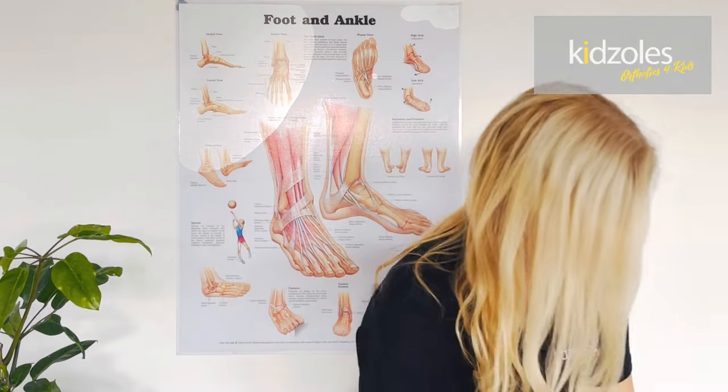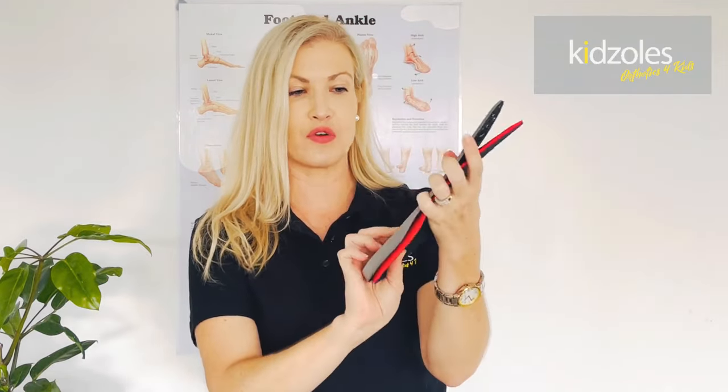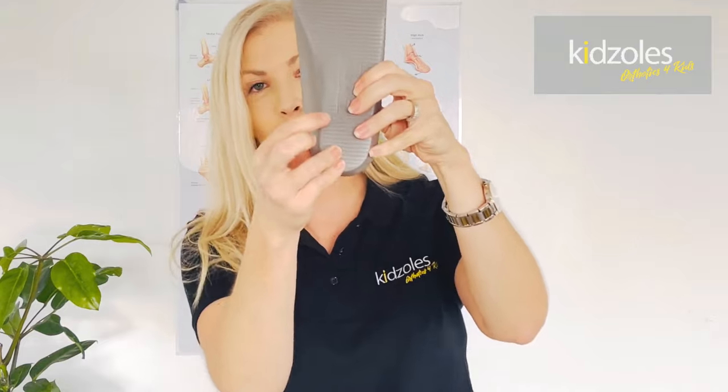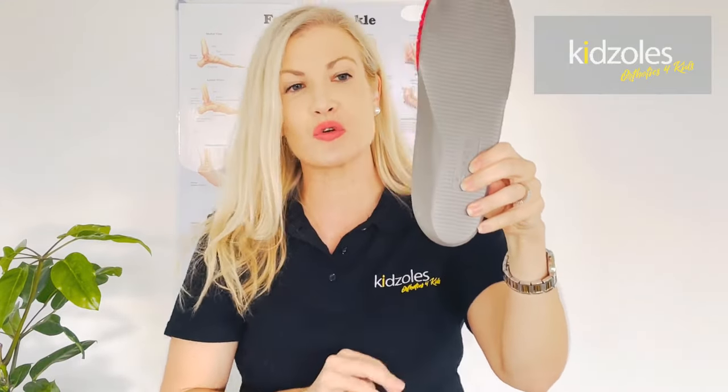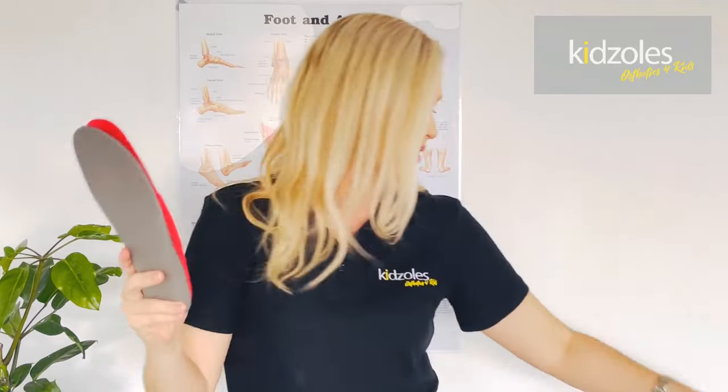Back to fitting: grab the coinciding insole and just pop it over that left orthotic. Underneath the orthotics you will have L and R — just make sure you've got the right orthotic, because we don't want the kids being tilted in the wrong direction inside their shoes.